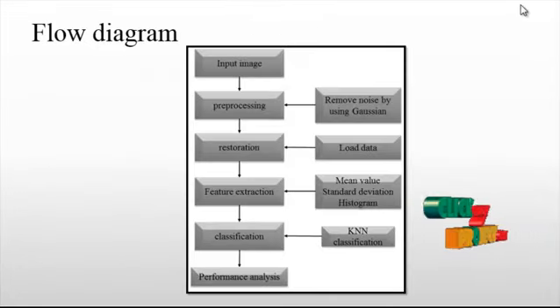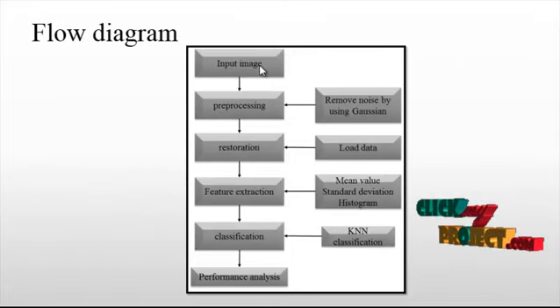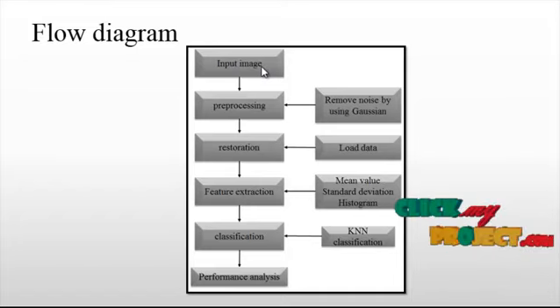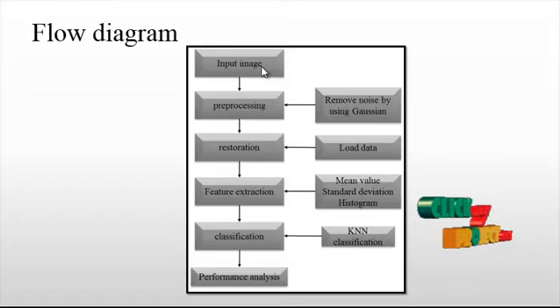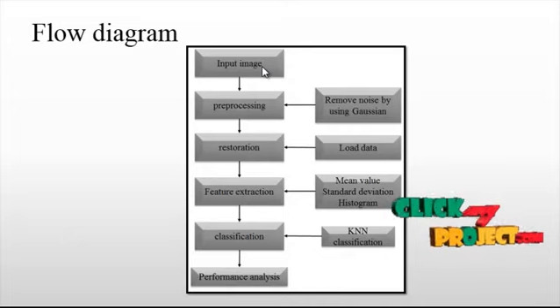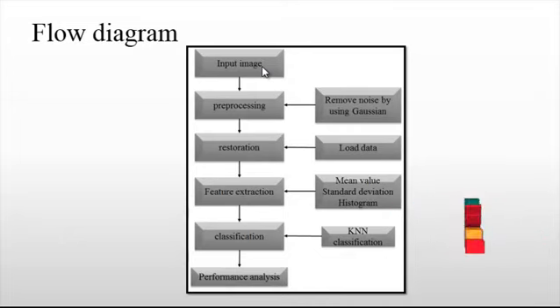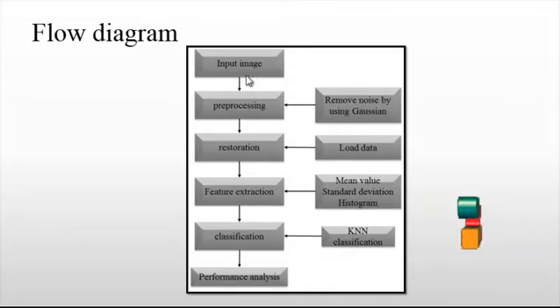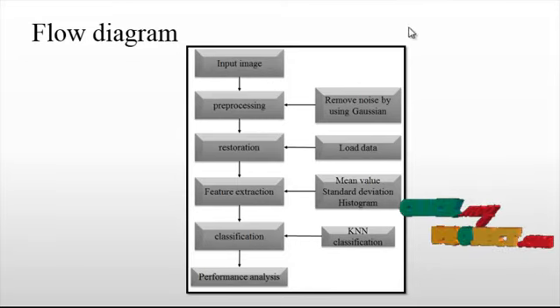Let us discuss the flow diagram of the project. First of all, the input image. The input images are taken from the lung data set. The exams were performed according to clinical needs and considerations; they did not follow a predefined protocol nor a strictly specified time interval between the scans, with no reports or where the segmentation process failed. To ensure the data set is a representative, typical ILD collection, no manual exam selection was made regarding either acquisition parameters, image quality, ILD class or ILD stage. So this is the process of getting the input images.